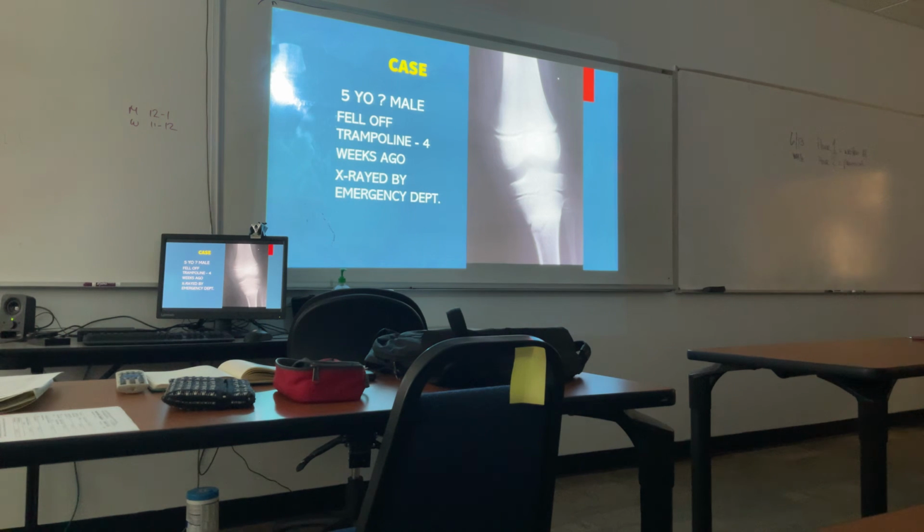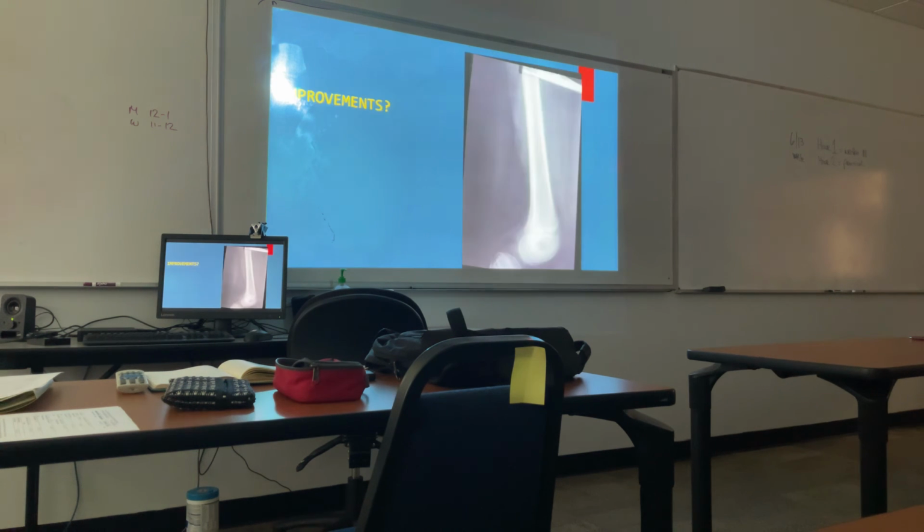Okay, now the next thing, what did we say was the teaching point on the trauma case? No, we said follow-up, right? 4 to 6 weeks later, this has to be re-x-rayed, make sure it heals well. That's your responsibility. The orthopedic surgeon says, I don't wanna mess with it, I've got another surgery to do. The chiropractic physician takes x-rays, he's capable of taking the follow-up films. Now, child or adult? Child. If you don't wanna deal with the little people, then say, I'm sorry, I don't treat kids in my office, send them somewhere else. Okay, whoever is your pediatric chiropractor of choice. Does that make sense? Okay.